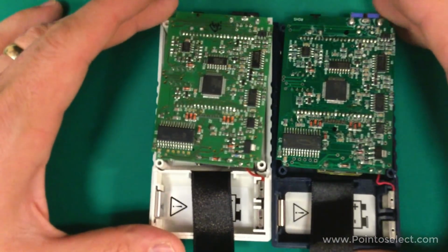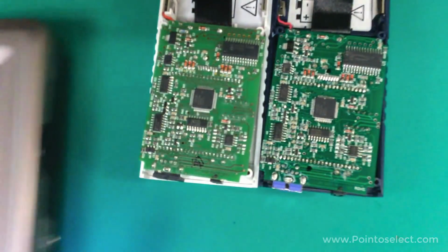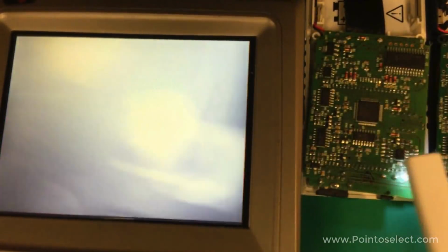Oh, hey, one other thing I just noticed. I noticed that there is a little serial number on the circuit board here. And so let me get the inspection camera in here again, and let's see if we can see that serial number. There it is. It's kind of hard with that light on that camera. LP LCD PSA V02. Let's look at this one.